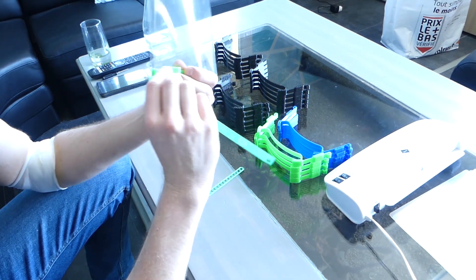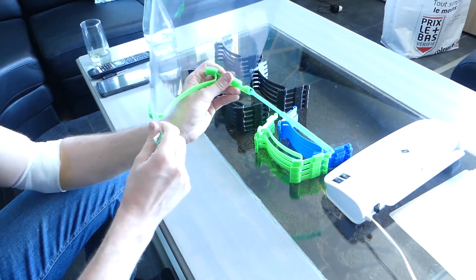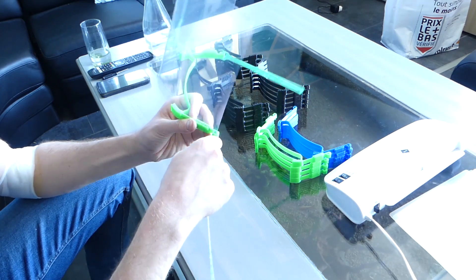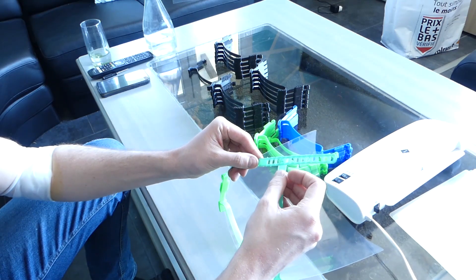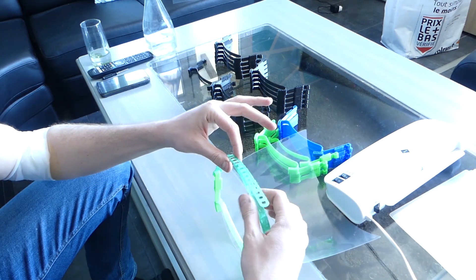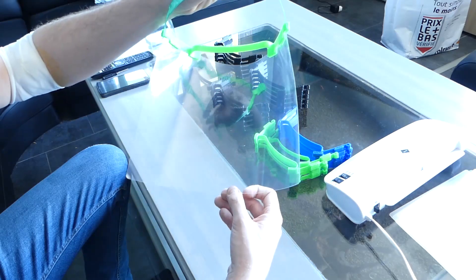Once that's done, all you have to do is put the clips in — these clips right there — inside the mask the other way around like this, and on the other side like this. Then place the rectangular piece where you want it to be, and turn the two parts to finish and complete the visor.